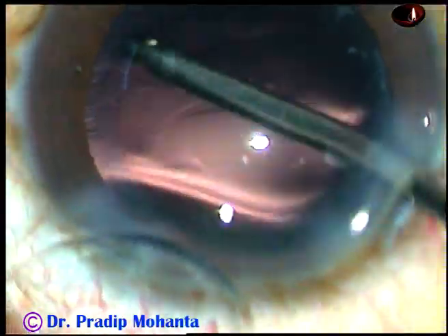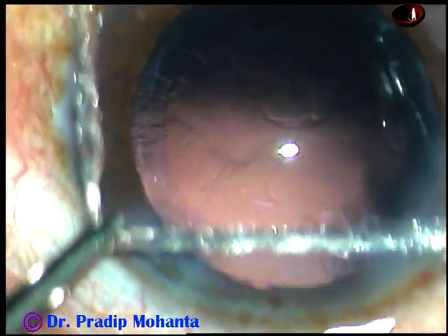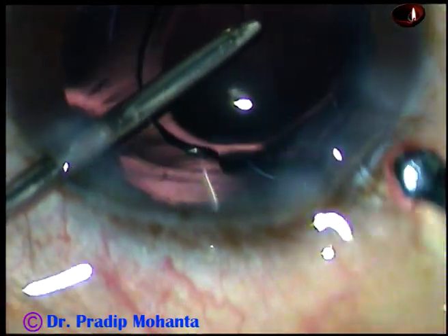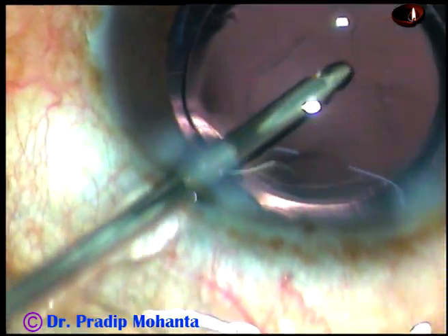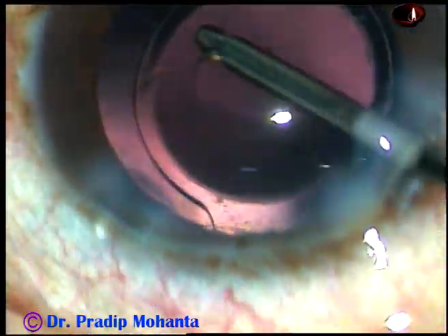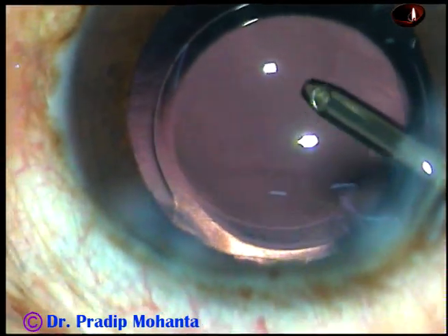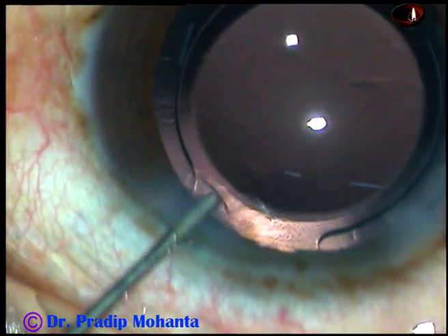And now I am using the irrigating probe of bi-manual IA for polishing the posterior capsule. And now I am going to hydro-implant an intraocular lens. I keep the anterior chamber formed by irrigation. Here goes a hydrophilic acrylic single-piece monofocal intraocular lens. Now I have asked for a Sinskey hook to check if the lens is in the capsular bag or not. I can hook the rhexis margin over the haptic, so it is in the capsular bag. If you can touch the rhexis margin at the area of haptics, then the lens is in the capsular bag.